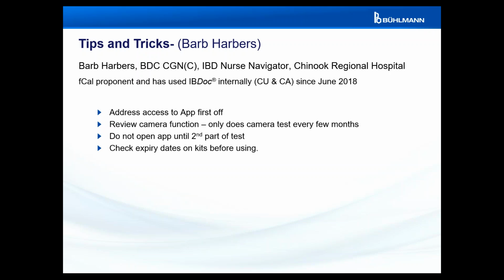Open up the app, carry on. You'll have to scroll through a few slides, but once you get to the second half, then carry on, because really it just saves a lot of grief, and we know that they've done their 2 hour window wait. And that's actually worked a lot better for my patients, and they found that a lot easier to go on.